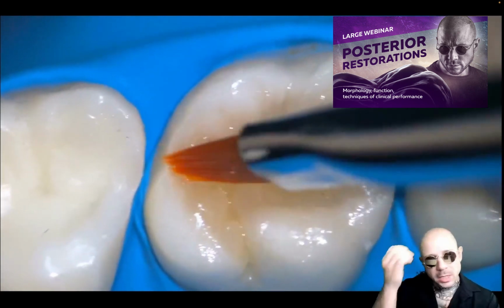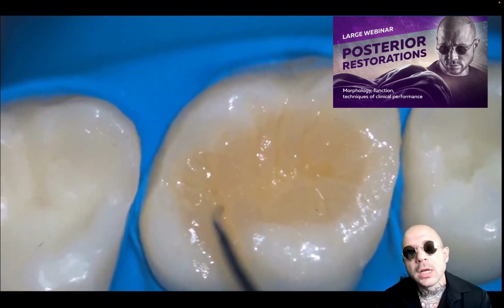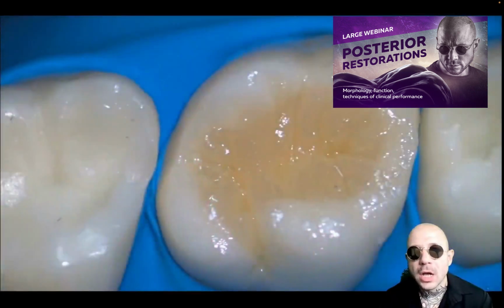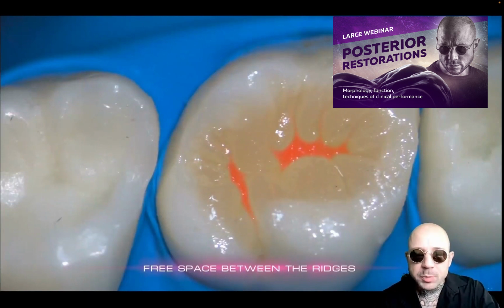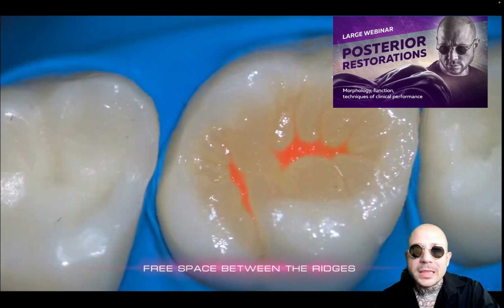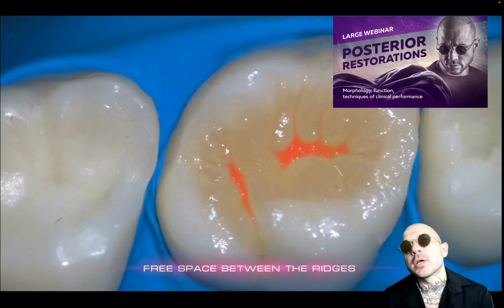Well, as you can see, I apply ridges one by one, but without getting contact between the ridges. Some free space between the ridges was left, and it was left deliberately, because the method of small increments, small portions, is not very convenient for possible corrections.